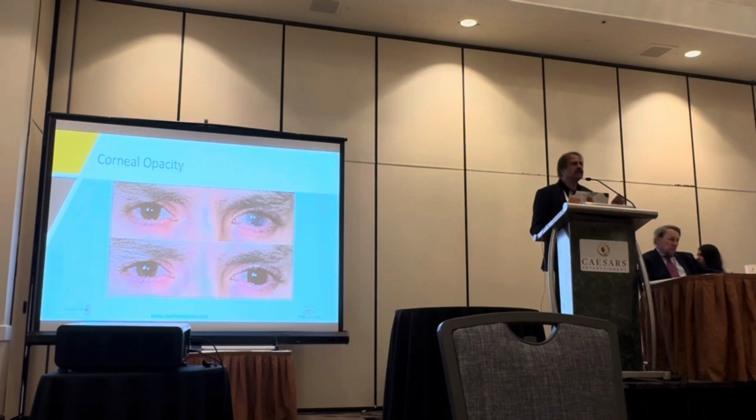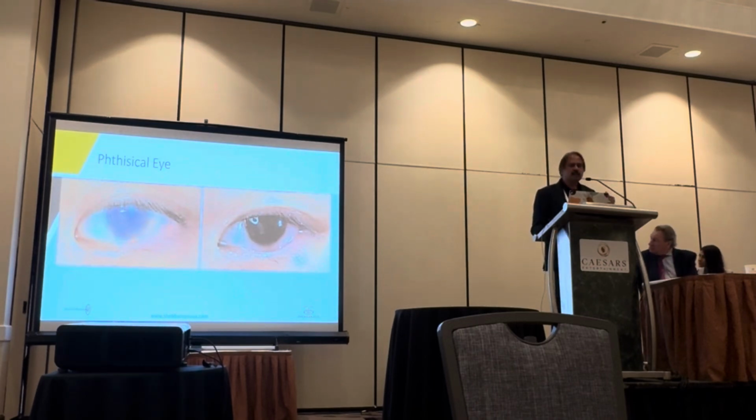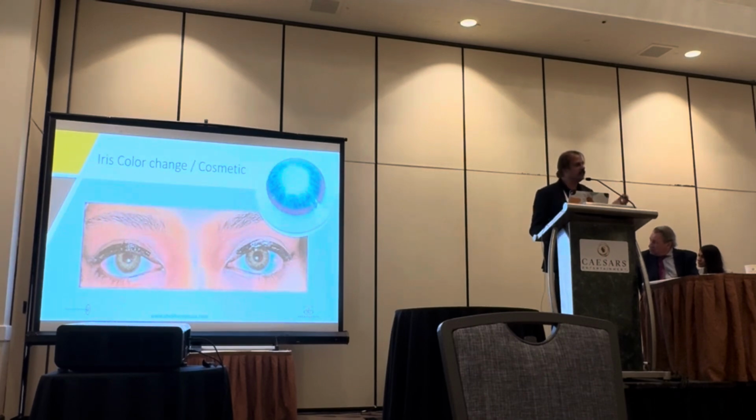We usually ask for about 90 microns of extra clearance all over, including the limbus. And of course, if it is a straightforward corneal opacity, then it works fantastic. Of course, the color does not match 100% in different lighting conditions. It looks different, and that has to be borne in mind. If it is a brownish color, it usually works, but if it is a lighter color, then there is a challenge.